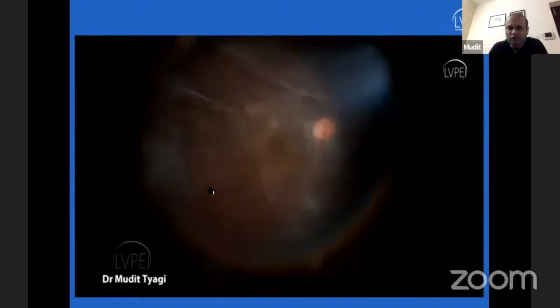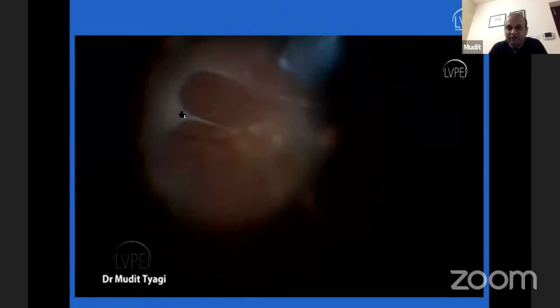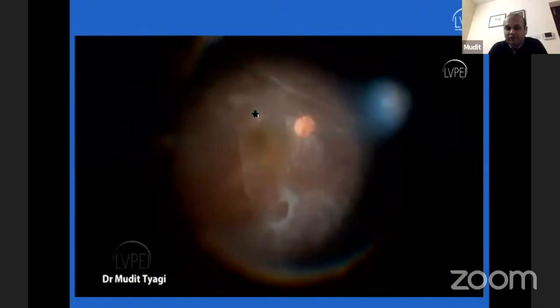And this vitreous is abnormally adherent. You see these peripheral areas of vitreous bands, and these membranous bands are there, and you need to take care of them. Until you remove them, you will not be able to successfully settle your detachments.